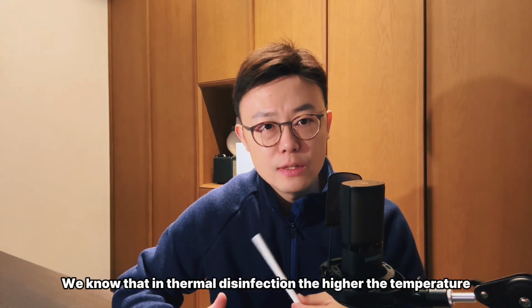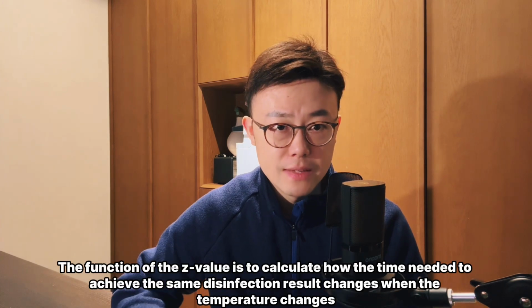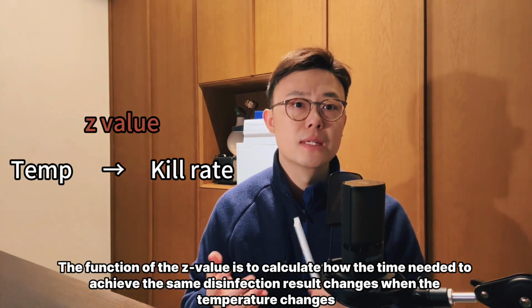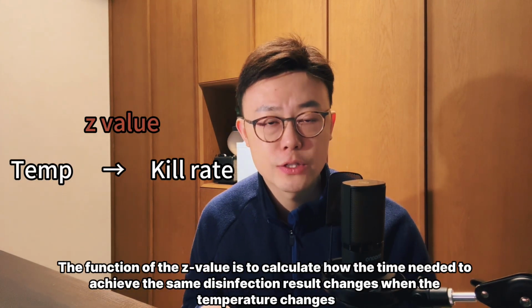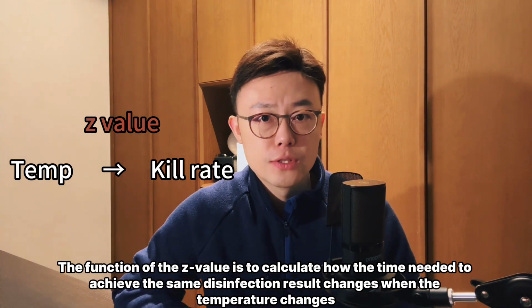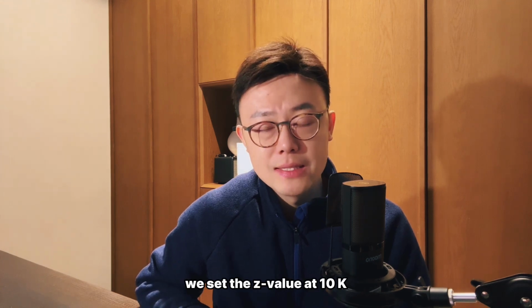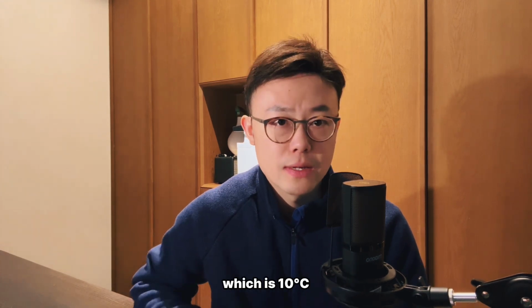We know that in thermal disinfection, the higher the temperature, the faster the kill rate. The function of the Z value is to calculate how the time needed to achieve the same disinfection result changes when the temperature changes. For thermal disinfection processes, we set the Z value at 10 K, which is also 10 degrees Celsius.